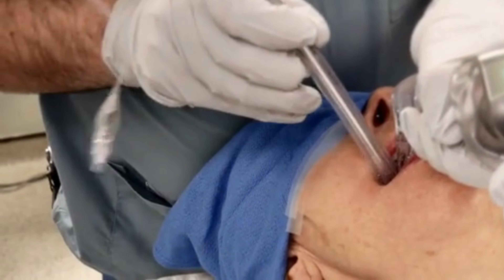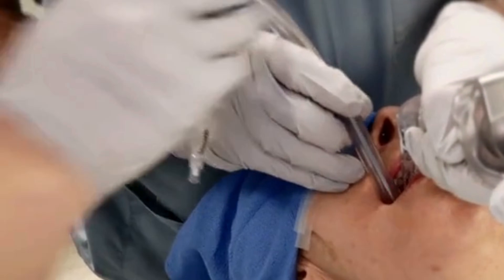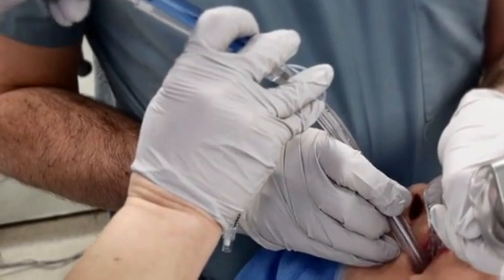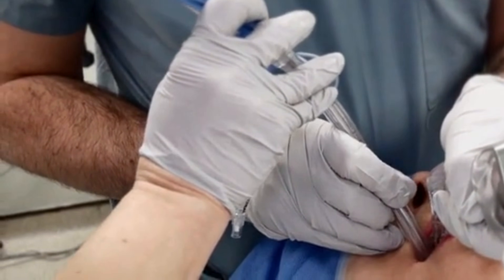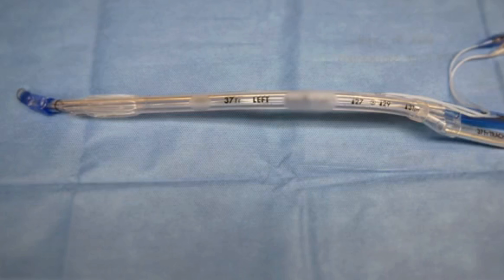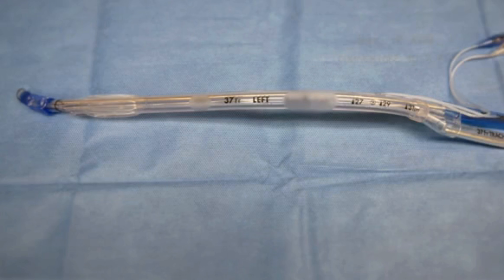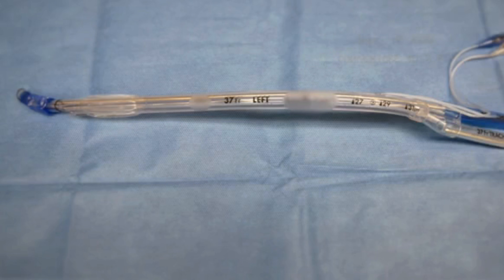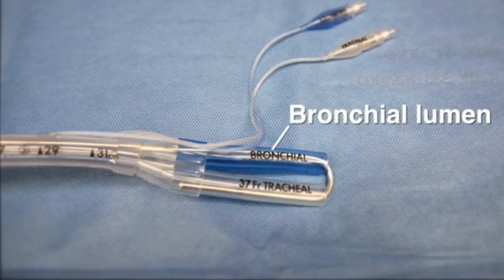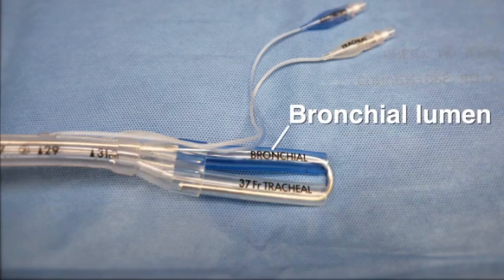Placement of a double lumen endotracheal tube is an airway management technique that permits isolation and selective ventilation of a single lung. Double lumen endotracheal tubes consist of a bronchial lumen and a tracheal lumen. The bronchial lumen is longer with a distal opening designed so that it can be placed in the right or left main stem bronchus.